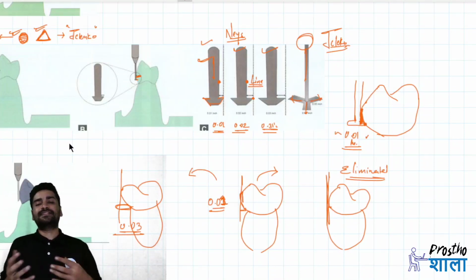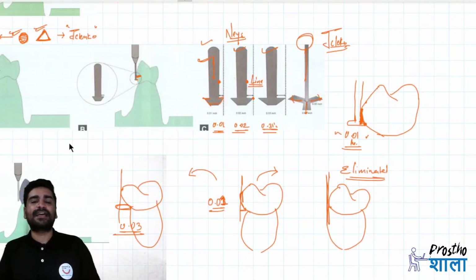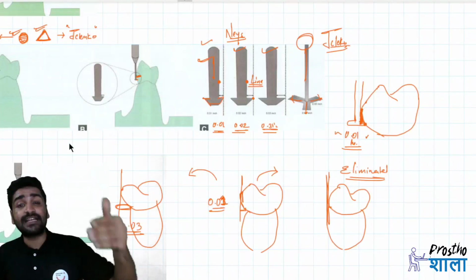So based on the depth of the undercut, you determine which type of clasp you are going to put in that RPD. It is not always a C clasp like an acrylic partial denture. When we talk about cast partial denture, we have different types of direct retainer, or you call clasp. Those different types of clasps are used in different clinical scenarios.